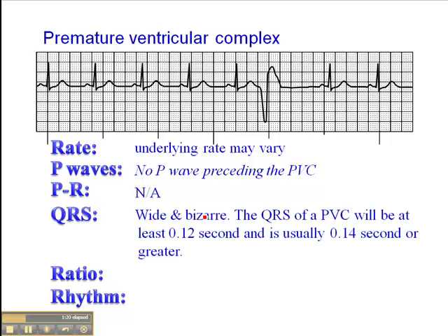The QRS is wide and bizarre, and that's key. The QRS has to be at least 0.12 second or greater. The QRS of a PVC will be at least 0.12, but it's usually 0.14 second or greater. The beginning of the QRS starts about here and the end is roughly there — this is probably the T wave, or the ventricular repolarization phase. Just by looking at it, we can see this is a wide QRS, so there's probably no great need to measure it in detail.